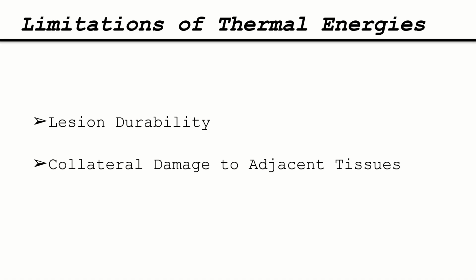Now, what are the limitations of these thermal energies? Actually, the lesion durability and the collateral damage to adjacent tissues. What about lesion durability?